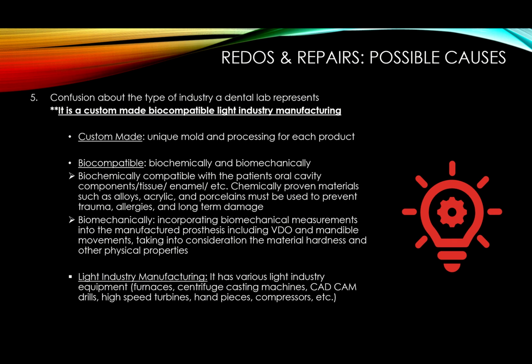Same thing. One of the amazing things that I've seen in my world is a type of glaze that's not for dental, and people use it, and it has a certain way of applying it, and I don't know how porous that glaze is, or what it does. Does it really seal the porousness of the ceramics? I don't know, and I don't want to know. I don't want to use it. I just want to use things that are specifically for this dental field, and the best of it, actually, not just any glaze, but the best that I can try and use. All right.